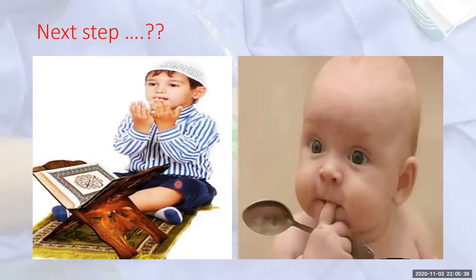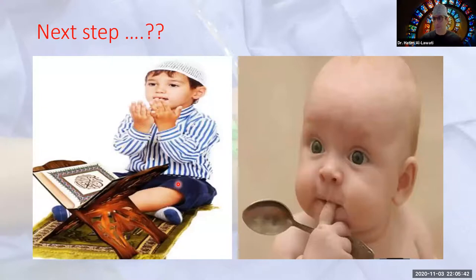Dr. Hatem. I would put a wire down that occluded left main and wherever that wire lands. The idea here is to try and abort the infarct, which is causing a lot of hemodynamic and electrical instability. So cross with the wire, wherever the wire lands, balloon, establish flow, whatever the flow might be, but at least some flow, and then take another angiogram and assess the situation and take it from there.